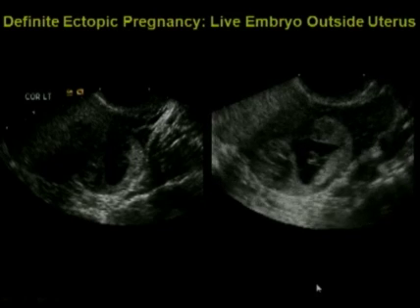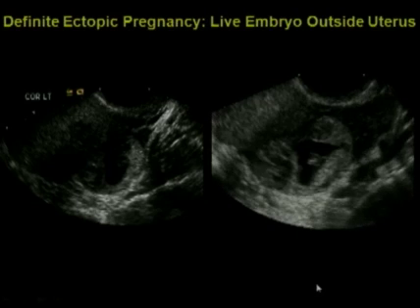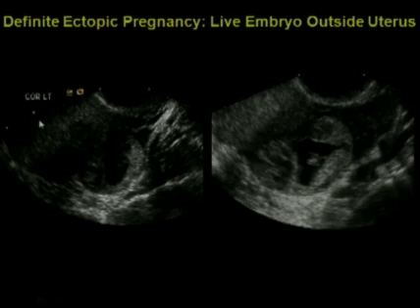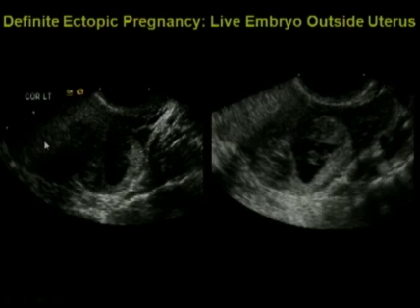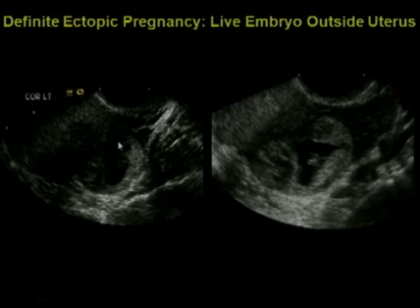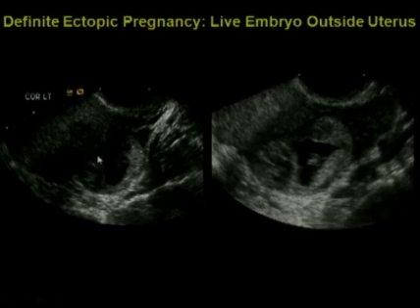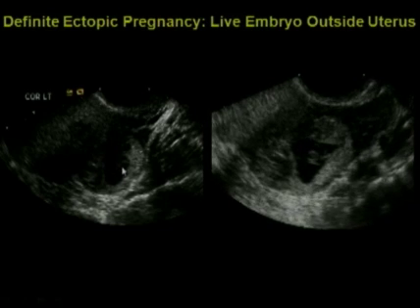Here's a definite ectopic pregnancy. There's a live embryo outside the uterus. Here's the uterus on a transverse or coronal transvaginal view of the pelvis. And here in the left adnexa, we see a fluid collection surrounded by a bright ring called a tubal ring. But more importantly, we see an embryo inside.